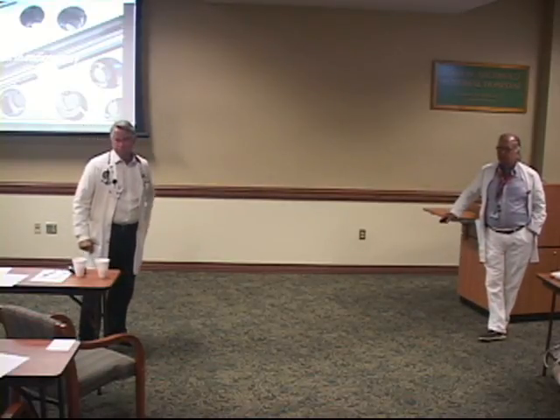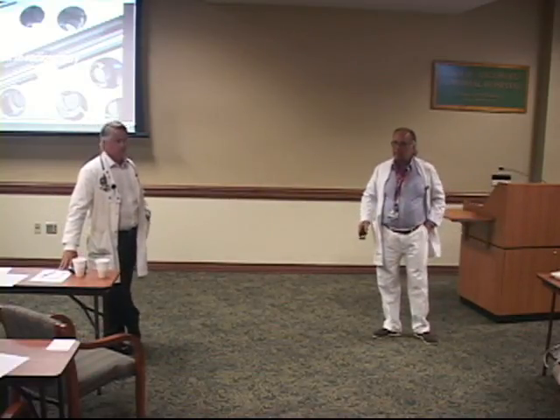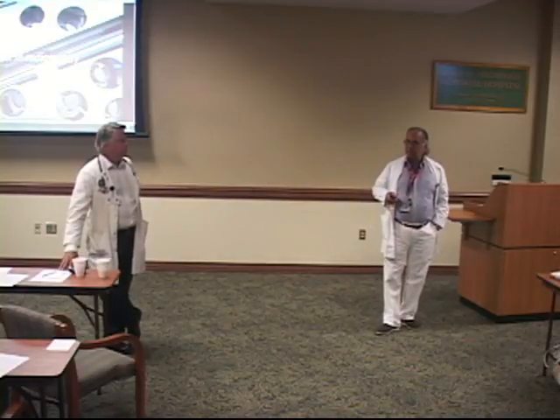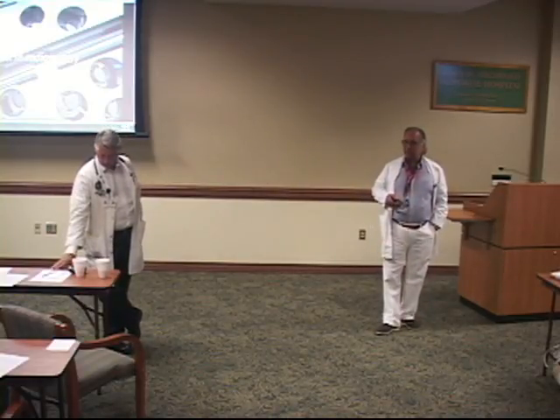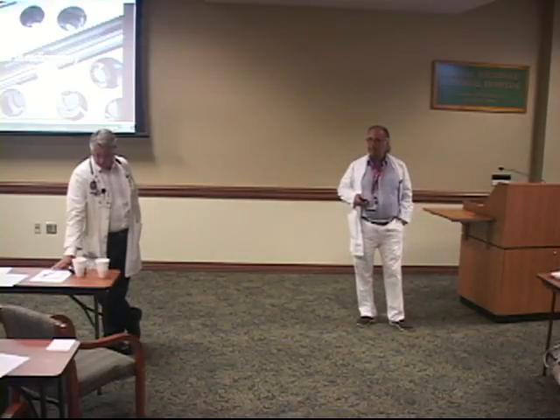Now, we have got a few people waiting for the new machine, but these are all slow growing too. We've got a patient with an AVM that we have to treat, and several vestibular schwannomas, and a couple of trigeminal neuralgia patients that are waiting for the new machine.